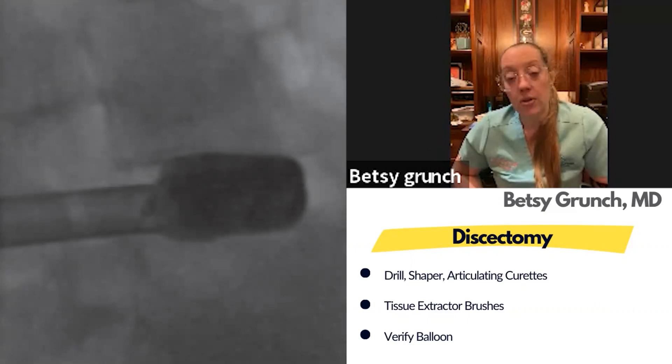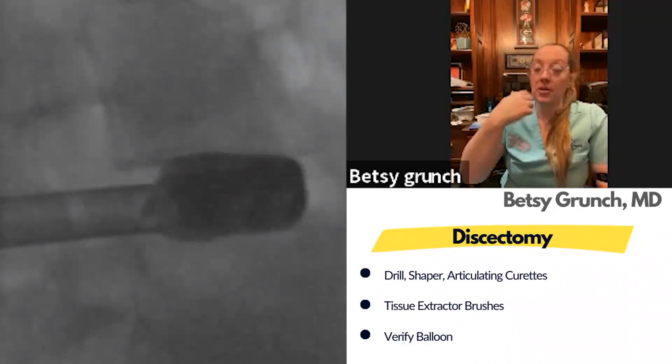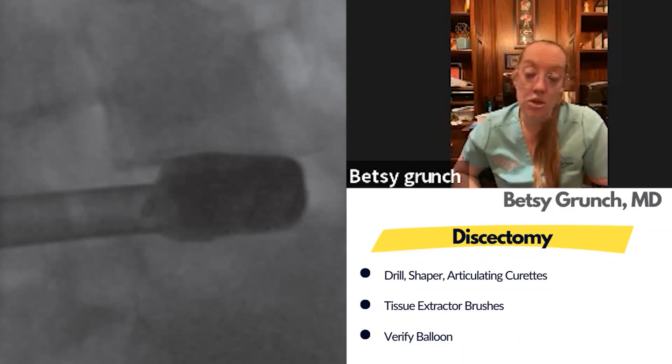The last step is the verify balloon, which is similar to a kyphon balloon but has contrast dye in it. You place it into the disc space and inflate it to see how much disc is gone. This shows an absolutely perfect discectomy with clean end plates. If there's still a piece of disc remaining, you can do more work until you achieve that clean appearance. The balloon really confirms the quality of your discectomy.